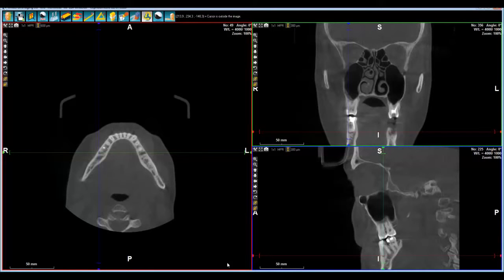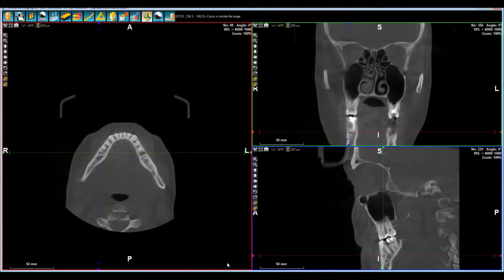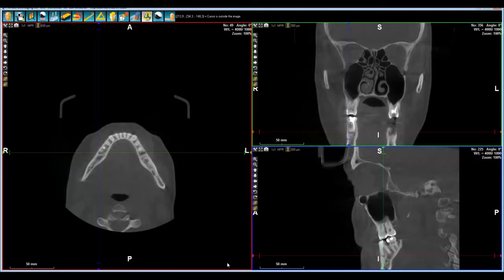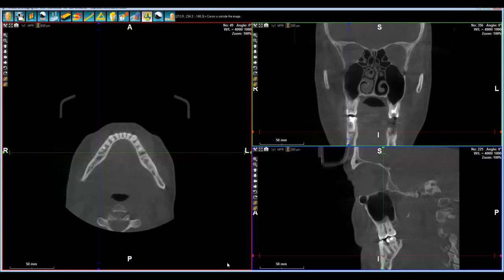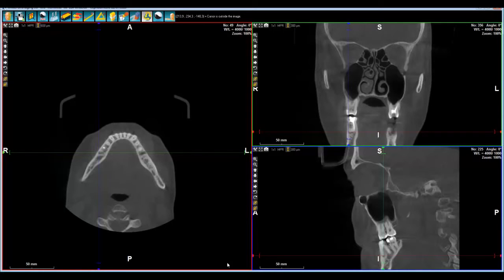There is a nice feature on White Fox Imaging in case you're working with referring doctors. If a doctor sends you patients for a cone beam scan, you have different ways that you can communicate to your referring doctor. One of the easiest is to make a report, and it's also a commonly accepted one, especially if you have a good printer.